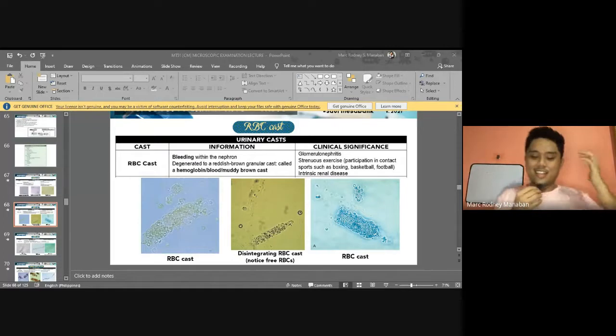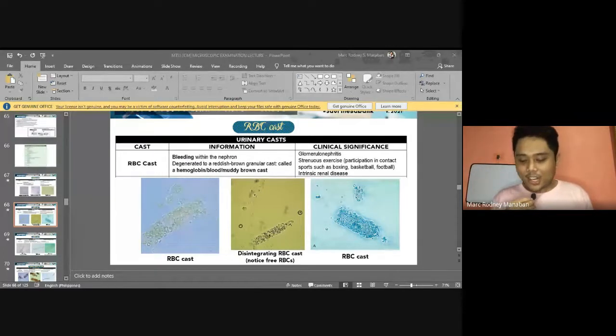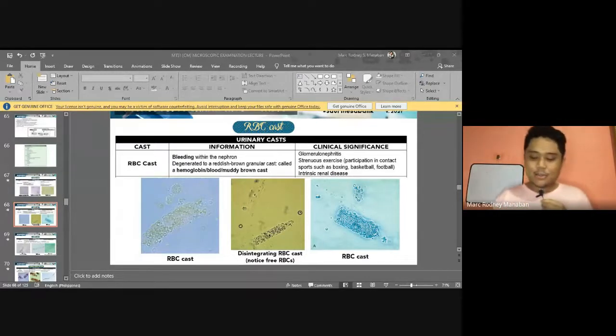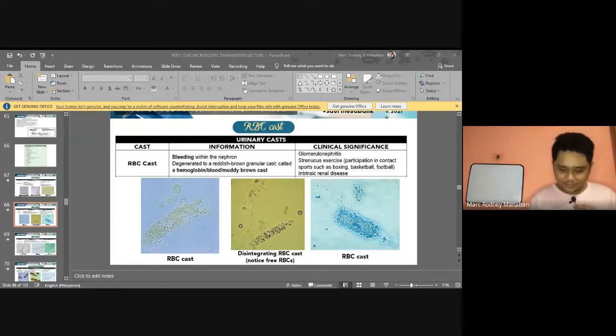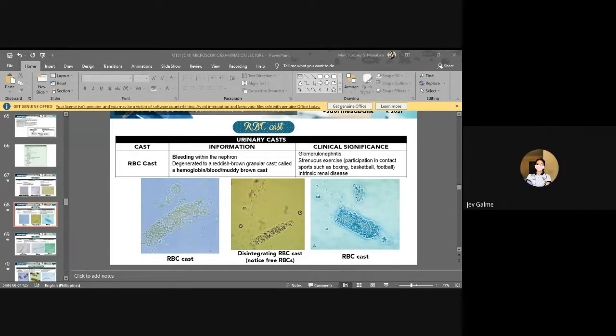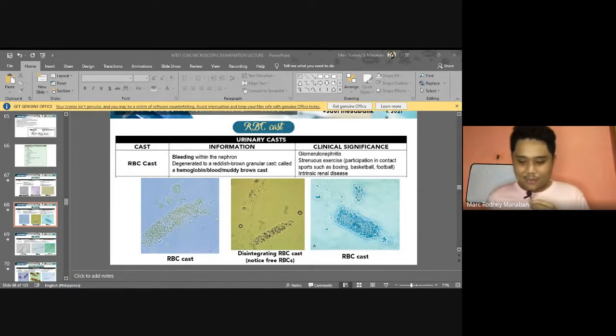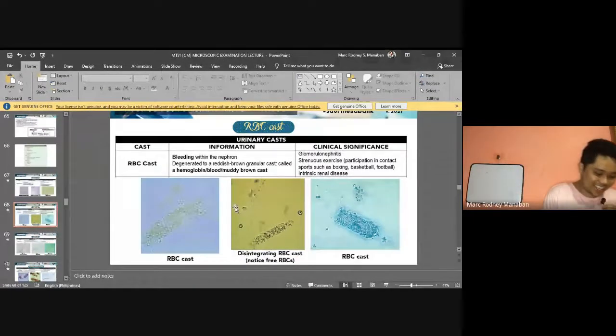Acetic acid. Okay, thank you for that, Den. Do you agree or disagree? What can be added to this reagent strip pad, especially for blood glucose, that can be affected by ascorbic acid, so that there is no interference? Yes, Jev. Iodate, sir. Okay, very good. Iodate. That's good. Very good. These are pop-up questions. Okay? We'll continue.